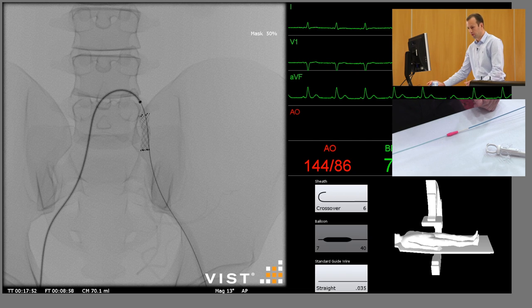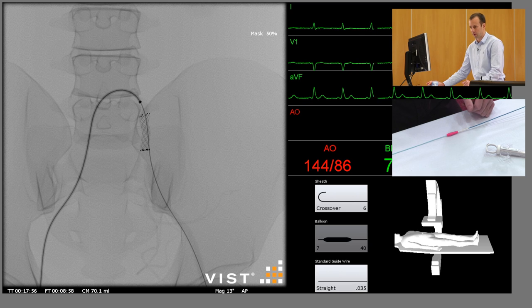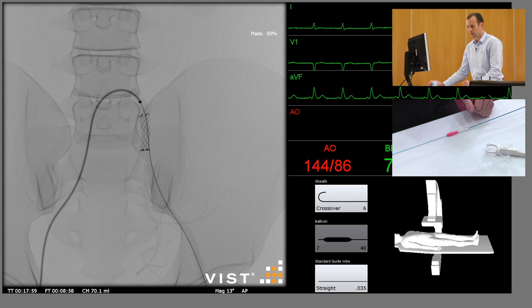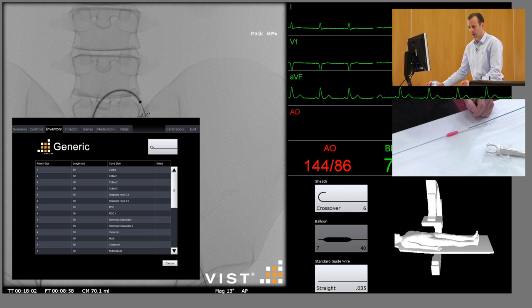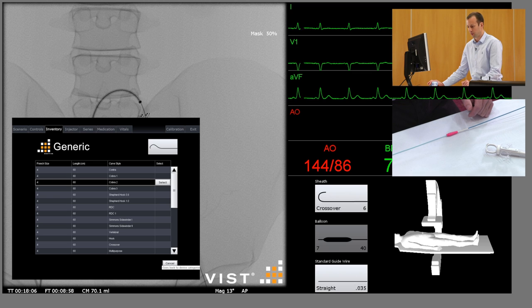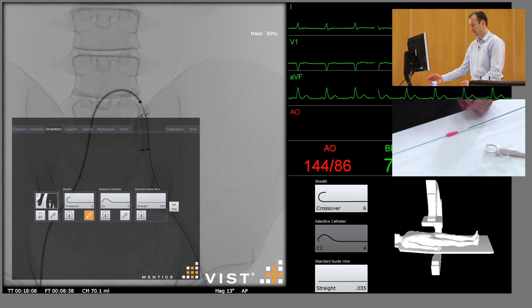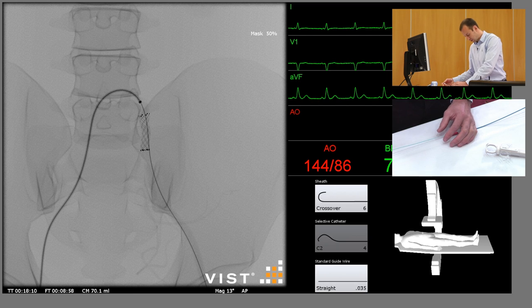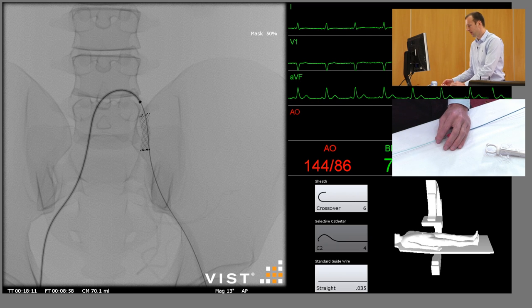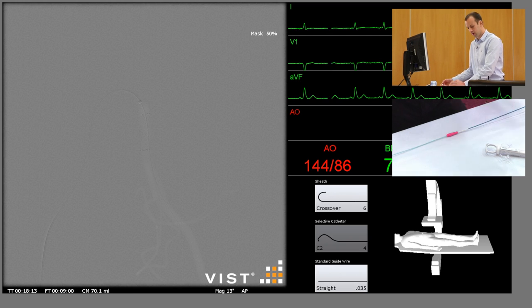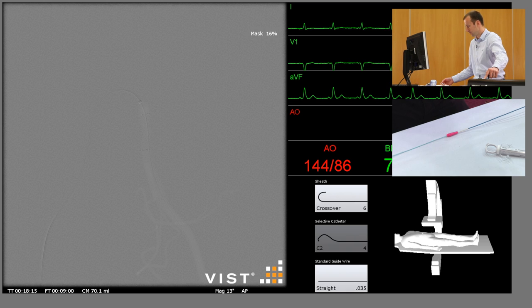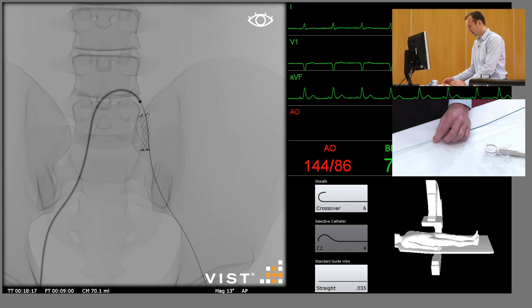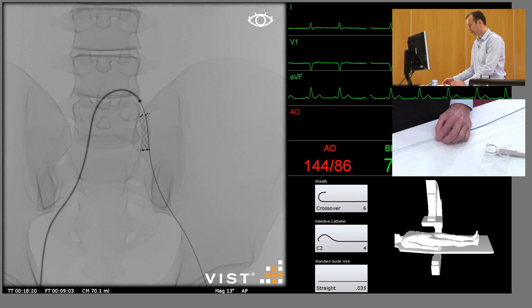And then the one final job is to check the superficial femoral artery. We know from the pre-operative CT scan that there is a stenosis of the superficial femoral artery, and so we should just go and take an angiogram of that. Use any of the diagnostic or selective catheters to do so. We'll just advance that through the sheath.